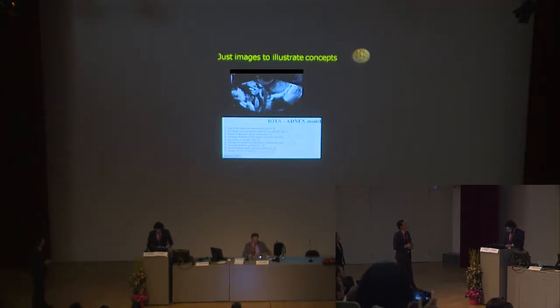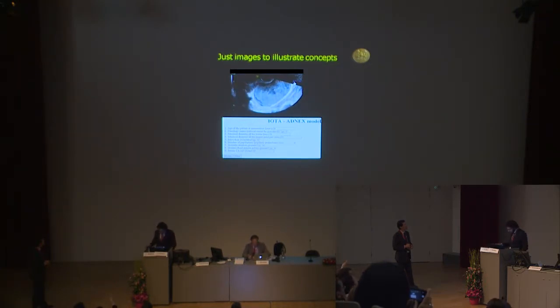Another case: this was a young pregnant patient, referred to a gynecological oncology center for a solid mass of 75 millimeters. The whole adnexal mass was solid, and there were no papillary projections. It was a solid mass without a cone of shadow. There was no ascites, and CA125 was slightly elevated, but we know that even in pregnancy it can be slightly elevated. Obviously, the patient didn't know of having an adnexal mass before getting pregnant.